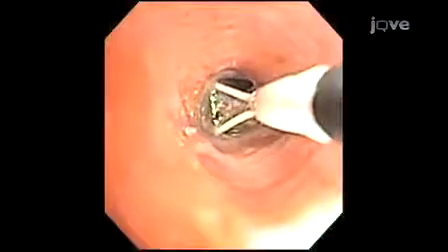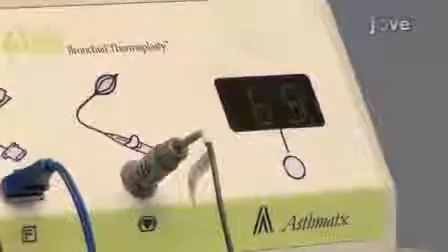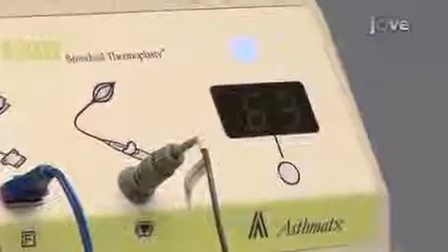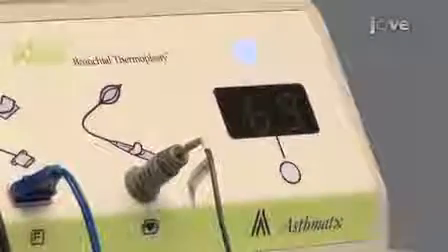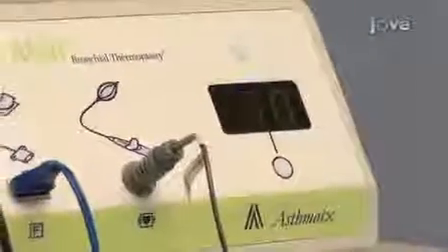The bronchoscopist must maintain contact of the electrode array with the airway wall, even while airways remain in motion from tidal breathing. The temperature set point, power limit, and delivery time are configured in the RF controller software and are not user adjustable. The cumulative number of activations is recorded on the Alair controller activation counter throughout the procedure.